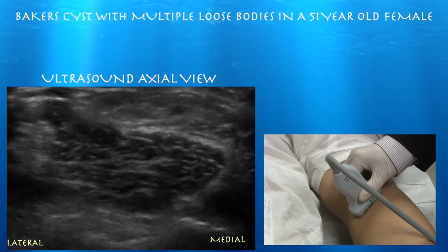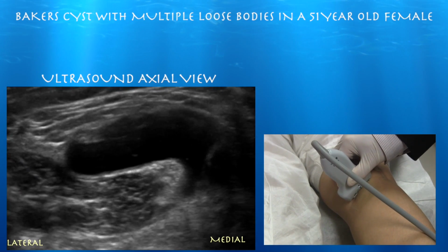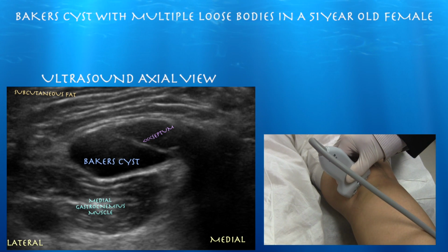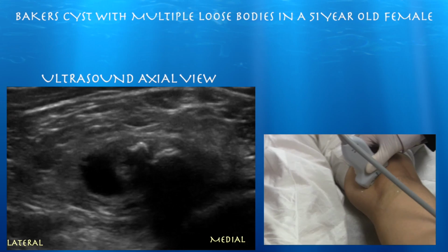Starting below now, and we're coming up. Here's a nice view of that channel as it comes up. Here's that septum coming across. Sometimes you get a better view of the septum in a different plane. Just keep going proximally. You can see those loose bodies form.